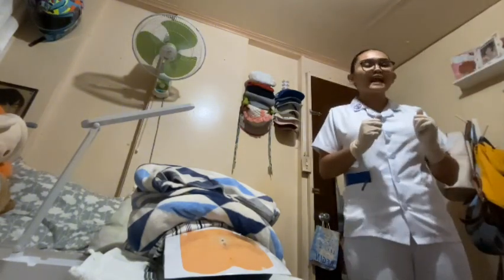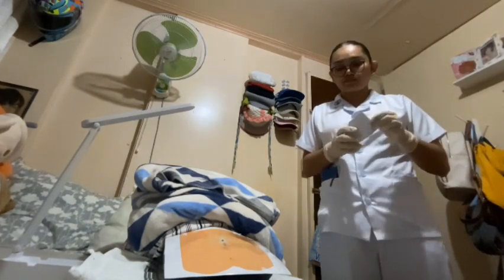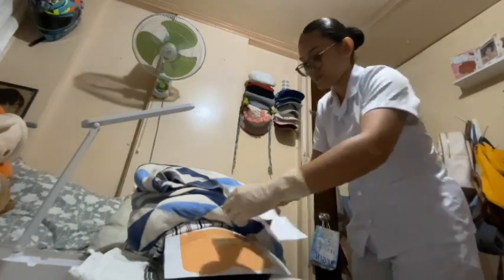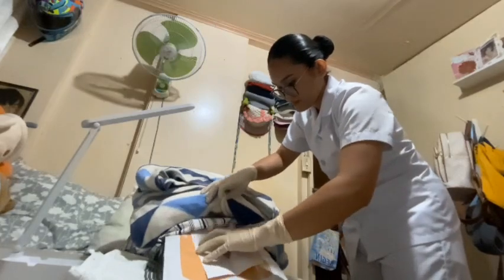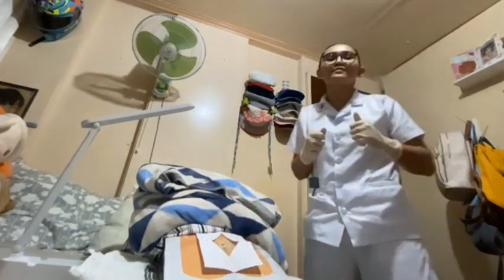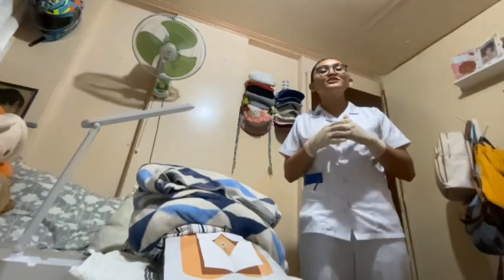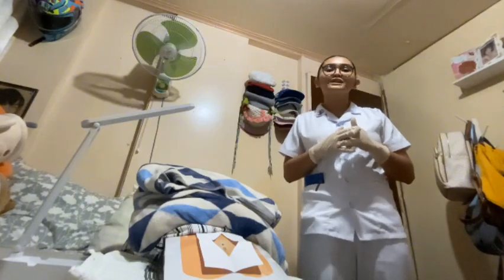Now, I will place the eye sheet over the area in order to maintain a sterile field throughout the procedure. Okay. So, after preparing the sterile field, I will cleanse the urinary meatus to reduce microorganisms and prevent infection during catheter insertion.